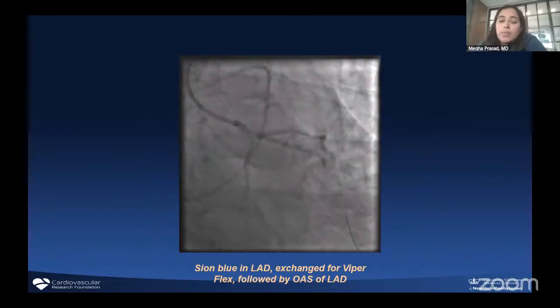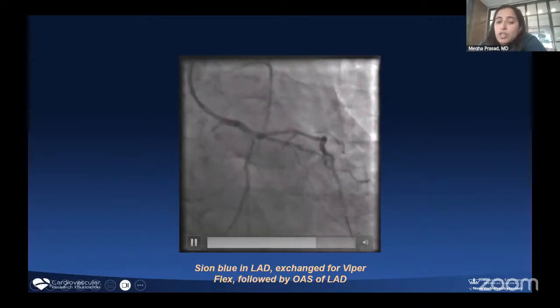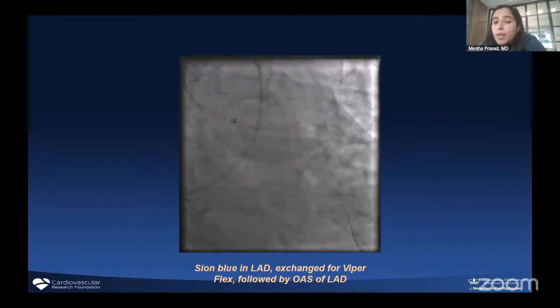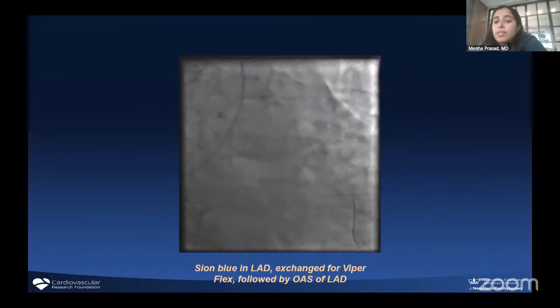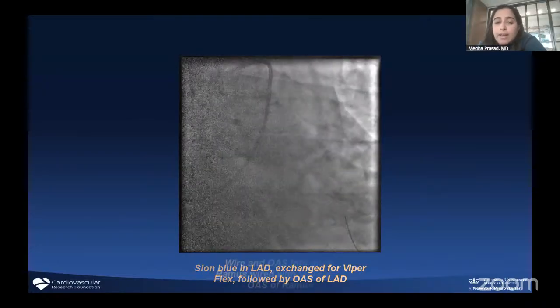And the reason for this was the IVUS didn't cross, and that's generally an indication to me that if the IVUS isn't crossing a 5 French low profile IVUS, we typically then reach for either rotational atherectomy or orbital atherectomy. In this case, the decision for orbital atherectomy was made in the setting of triple vessel disease and concern for any sort of hemodynamic compromise despite his EF being normal.